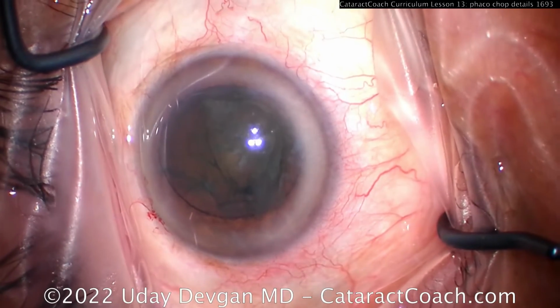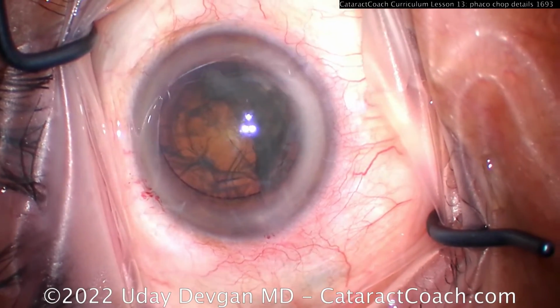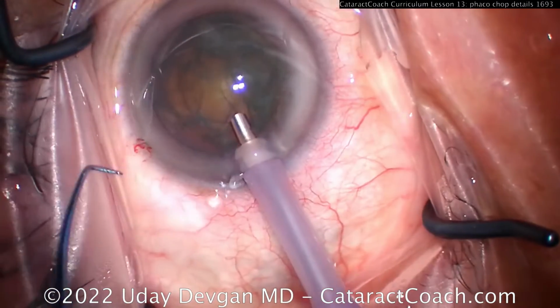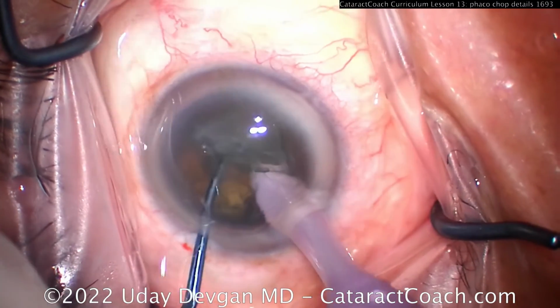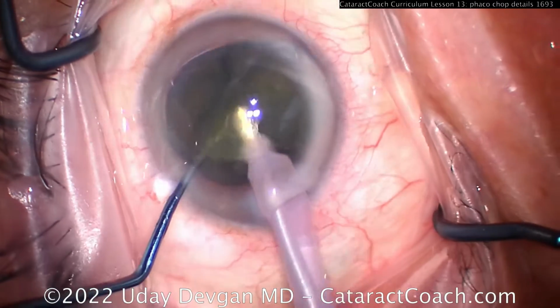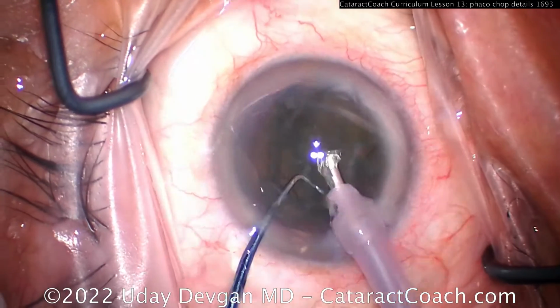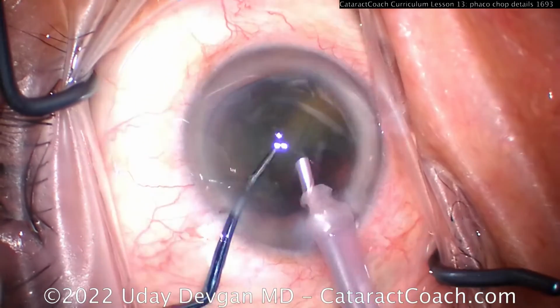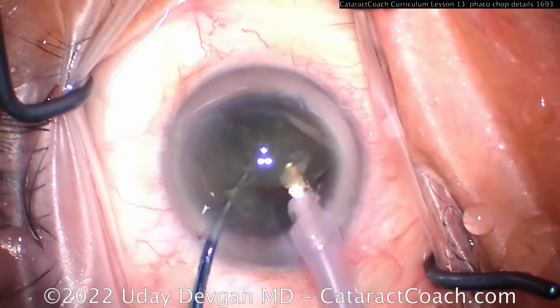And you'll see in this case, guess what? It's not a 2.2 tip. It's a 2.75 tip. Why is that? Well, there's no difference for me astigmatically because I make a nice incision. There's a lot more flow. So here in the chop setting, what am I using? Flow is 40 or 45 cc's a minute of flow. I'm using a vacuum level of at least 400, if not 500 millimeters of mercury. And then we're using an infusion pressure of about 80 millimeters of mercury.